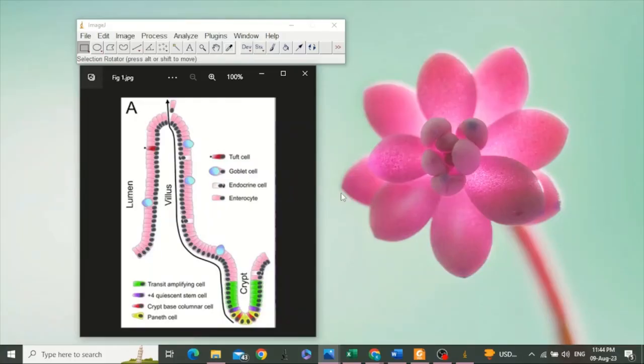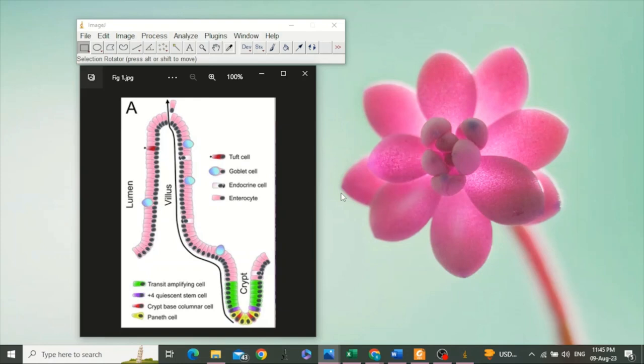Hello, in this video we will learn how to perform the morphometry of intestine with the help of ImageJ software or Fiji software. Morphometry usually includes taking the measurements of villus height, villus width, and crypt depth, as well as the ratio between villus height and crypt depth.